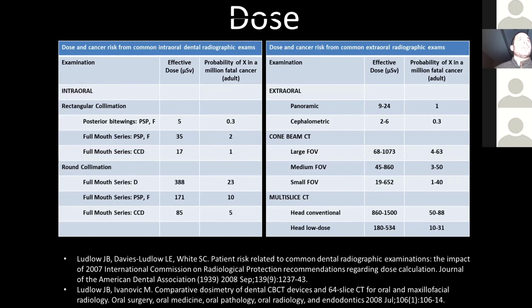Okay. Can you use a cone beam CT scan to help diagnose perio problems like infrabony pockets? Yes, absolutely. If you have a specific treatment need to look at the morphology of a specific pocket or crestal bone defect, the cone beam CT can help. Where it gets a little tricky is if there's metallic artifact that blasts through, streak artifact, if you will, that blasts through the crest. In that sense, you can supplement with clinical probing or vertical bite wings to get kind of the whole picture.